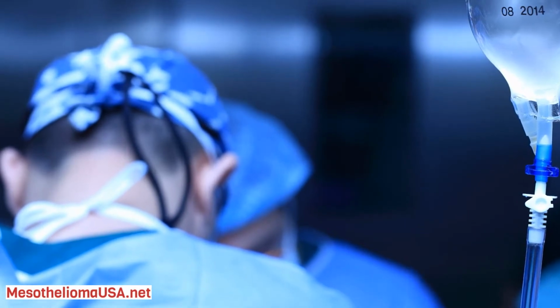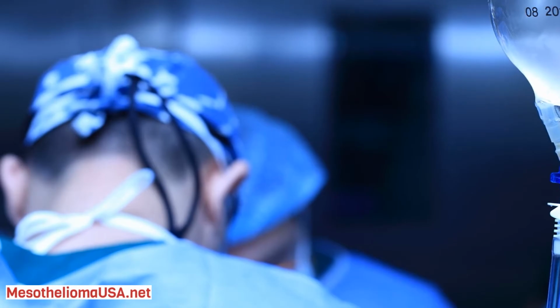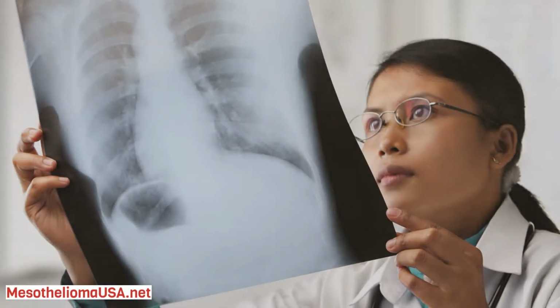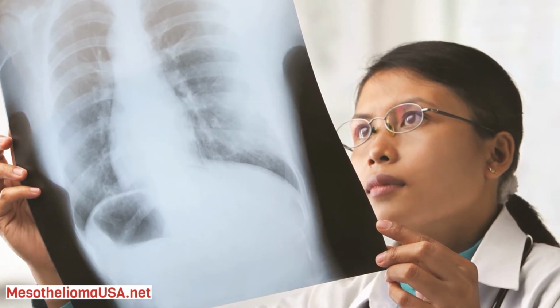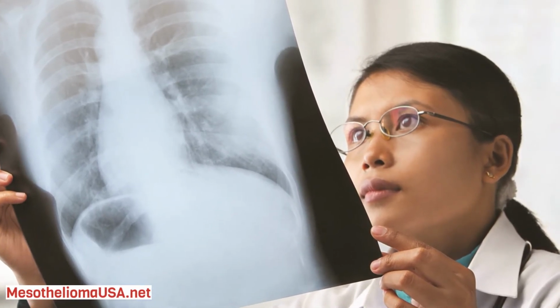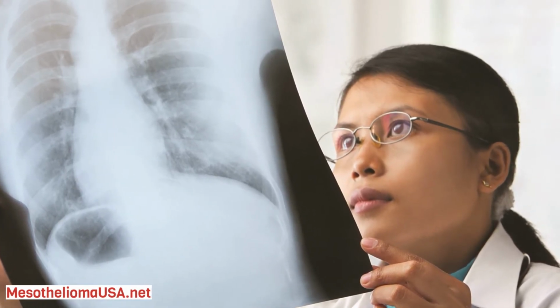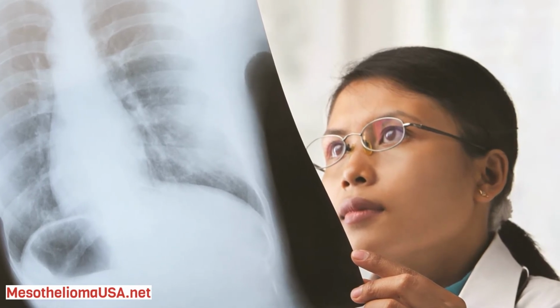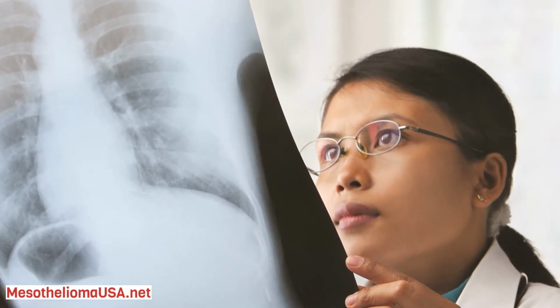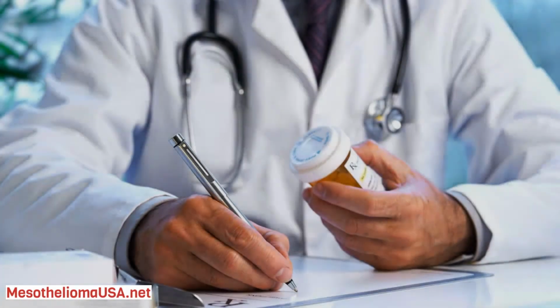In a study conducted by Ng and colleagues on 70 MPM patients, pleural thickening, 94%, and pleural effusion, 76%, were the most common pretreatment findings, similar to a study carried out by Sahin et al. on 84 MPM patients. Wang et al. named unilateral pleural effusion, nodular pleural thickening, and thickening of the interlobar fissure the key CT findings of MPM.